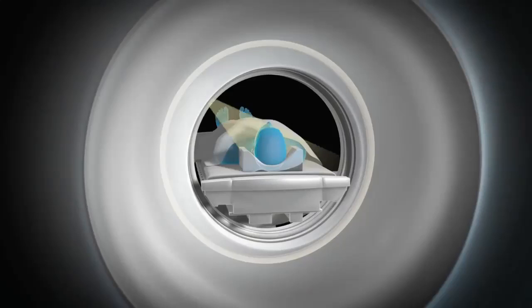Because the beating heart is very fast, one is not enough. They need 2 at the same time, like that, so they can produce 2 images in 1 second. Okay, so basically it's like this one.